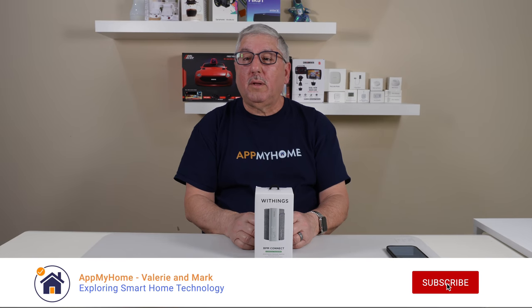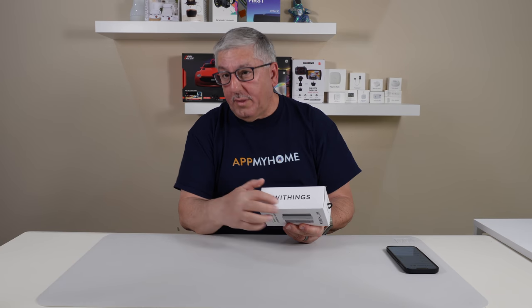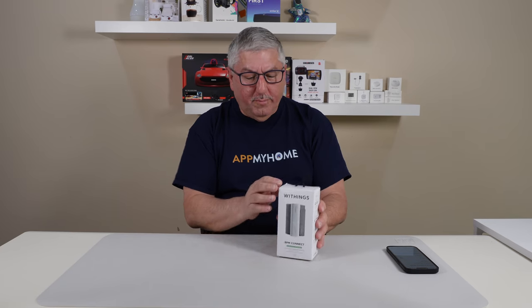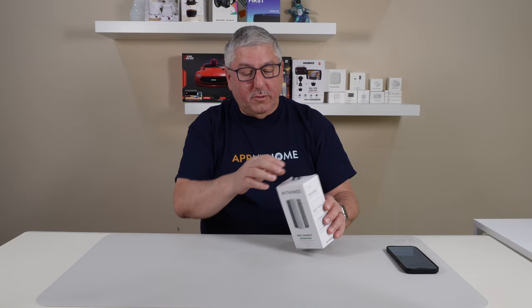Hi, it's Mark with AtmaHome, and today we're going to take a quick look at the Withings BPM Connect Smart Blood Pressure Monitor. This is really kind of cool — Withings, or is it Weethings, whichever way, this thing is pretty cool. Weethings sent us this for the review, so let's take a look at what's in the box.